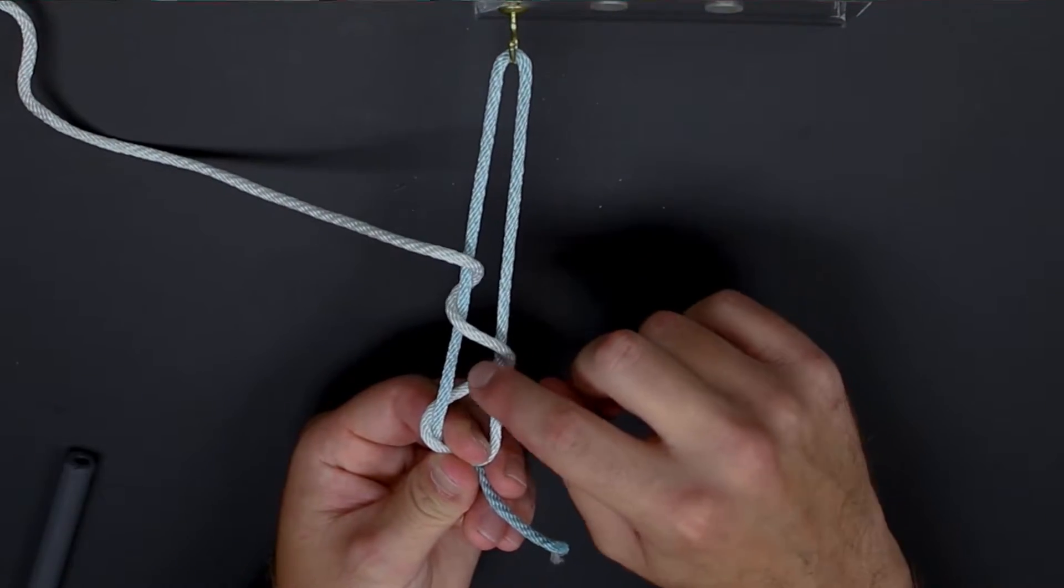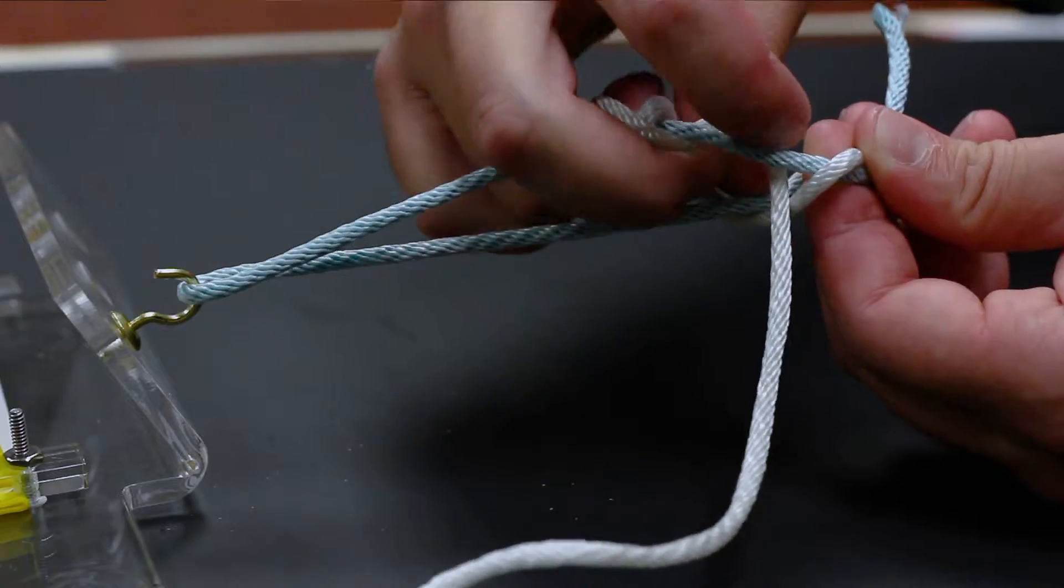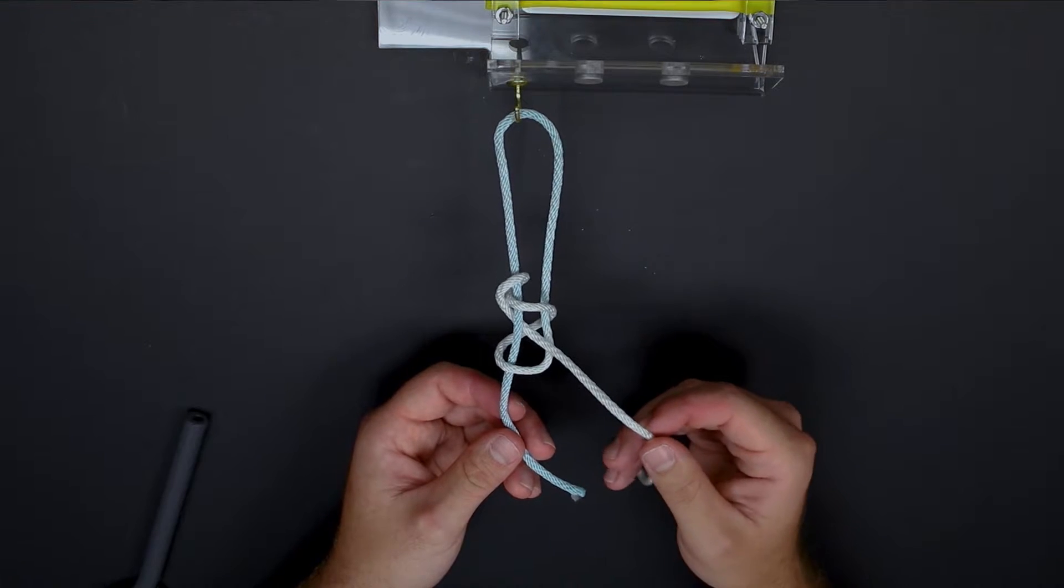You see how we then have this loop or triangle that we have created. We will pull the suture through this loop or triangle and then we have completed our knot.